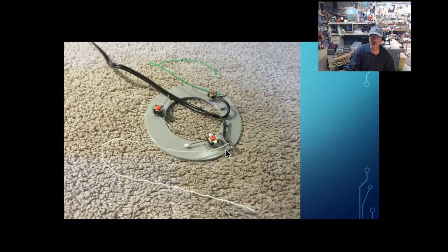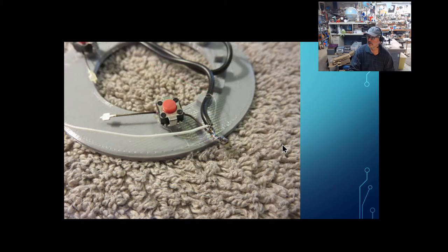And then you're going to take your hookup wire and strip a little bit of that off and wrap it right on top of what you've just soldered. Okay, one on one side, one on the other. I've used green and white just to make things a little clearer here. Here's a little bit more of a close-up of it. Just wrap it on top, solder it, and this little extra strand you see here, that's just a bit of hot glue that squirted out, so no big deal.